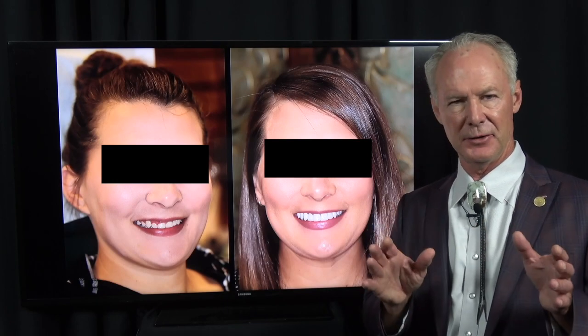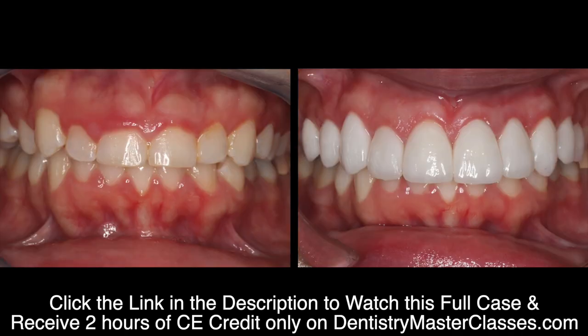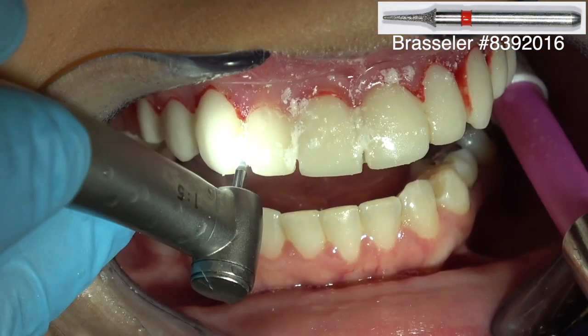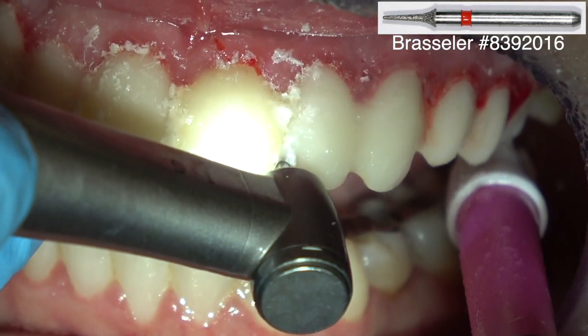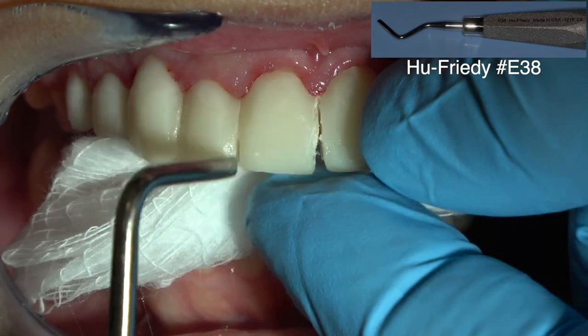In this case I'm going to talk about how you control gingival bleeding using 38% phosphoric acid. So this is a technique — you use this mosquito diamond and cut between each of the provisionals, and you're going to take an elevator and just torque them and they'll pop right off.